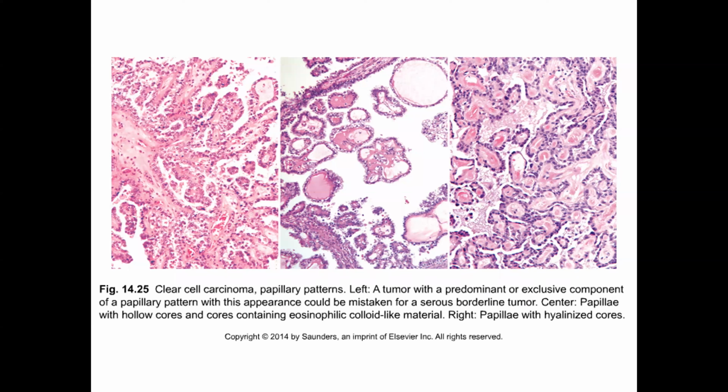Here's more features of this. And again, you can see how it has some similarity to papillary serous carcinomas. Not all of the cells have very pronounced clear cytoplasm. Not all of the nuclei form hobnails. And so not infrequently, serous carcinoma enters into the differential diagnosis.